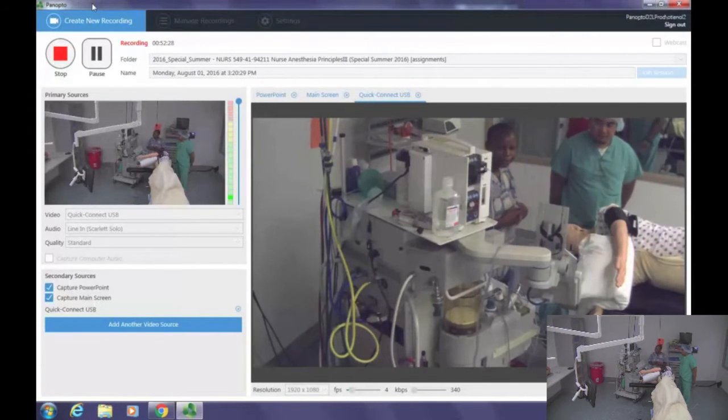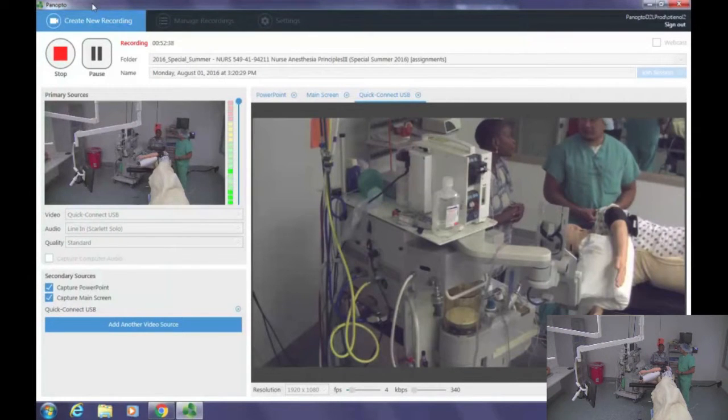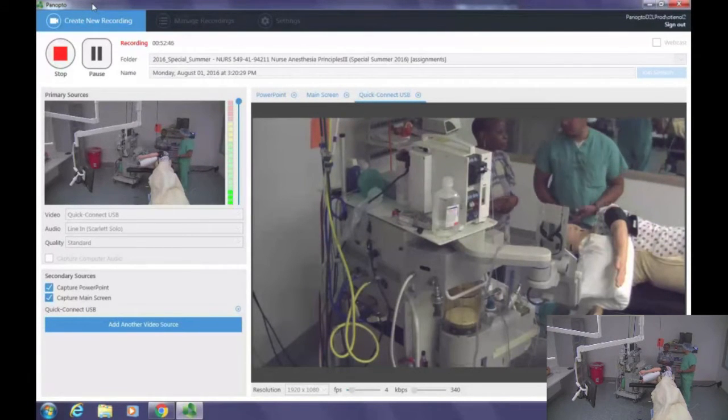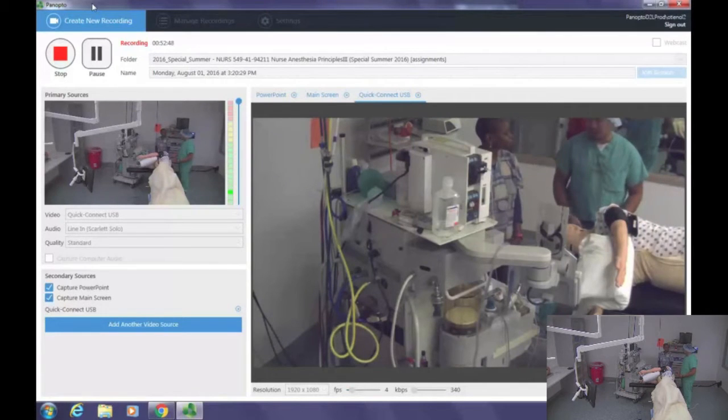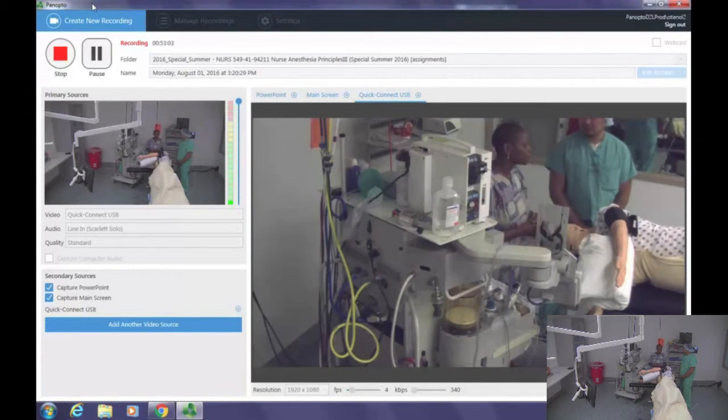All right. Mortality for this kind of procedure is around 1 to 5%. Morbidity, I already told you, is complications. Like I said, you could have bleeding, hypoxia and hypercarbia, that sort of thing. Also, these types of patients are prone to hypothermia because we're opening up the chest. So other than the Bair Hugger, we have to warm the fluids.